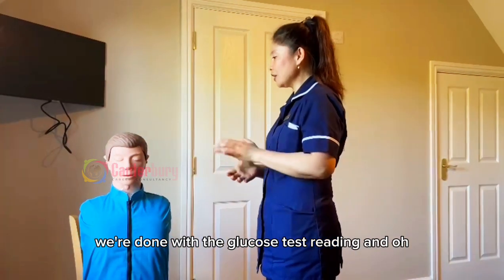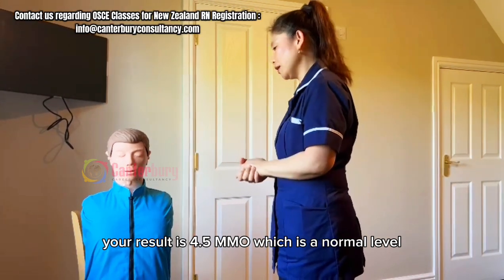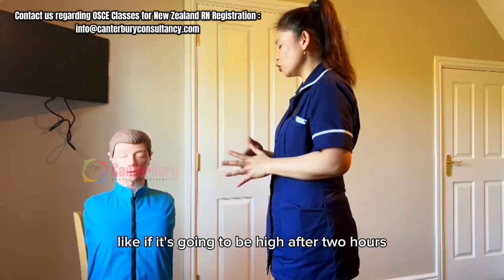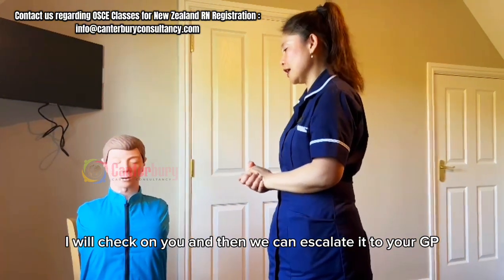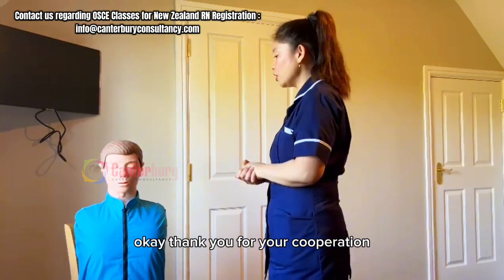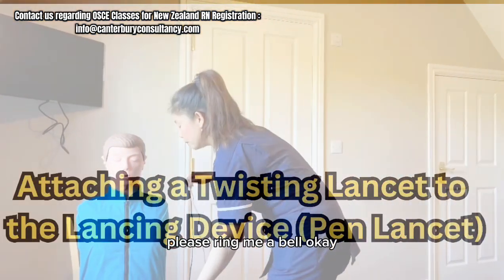That's it, William. We're done with the blood glucose test reading. Are you okay? Yeah, I'm okay. William, your result is 4.5 mmol, which is a normal level. So I will document it in your file. If it's necessary — like if it goes high after two hours — I will check on you, and then we can escalate it to the GP. If you have any more concerns, please let me know. Thank you for your cooperation, William. I will give you your call bell — if you need anything, please ring the bell.